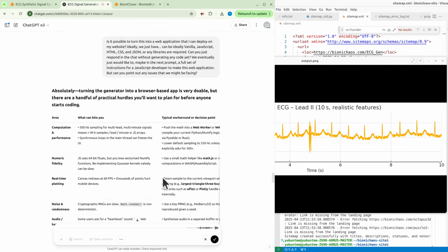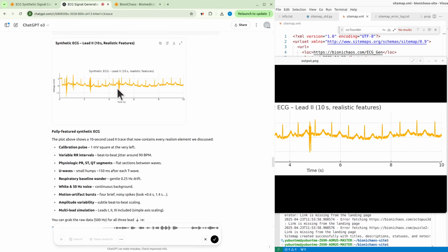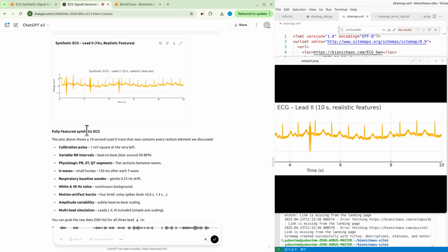Okay, so let's go over this quickly. Yeah, essentially the synthetic ECG that it generated the image for, an example of a 3-lead CSV file. They look good. I haven't checked the CSV, but the image looks really, really good. I'm not sure if we need the calibration pulse. I mean, we don't have a calibration function. We might actually have this as another web application of how you calibrate a recording, as in simulating a setup. But maybe in this case we can assume the setup is okay.